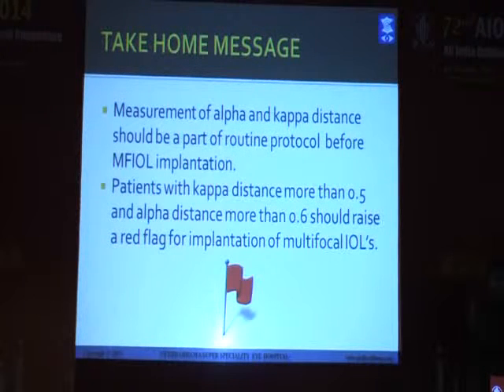My take-home message to all of you would be that measurement of angle kappa and alpha distance should be a routine protocol before multifocal IOL implantation, and patients with kappa distance more than 0.5 and alpha distance more than 0.6 should serve as a red flag for implantation of multifocal IOLs.